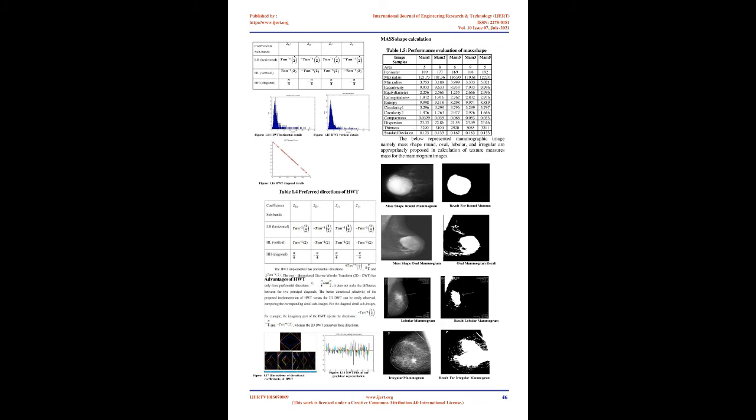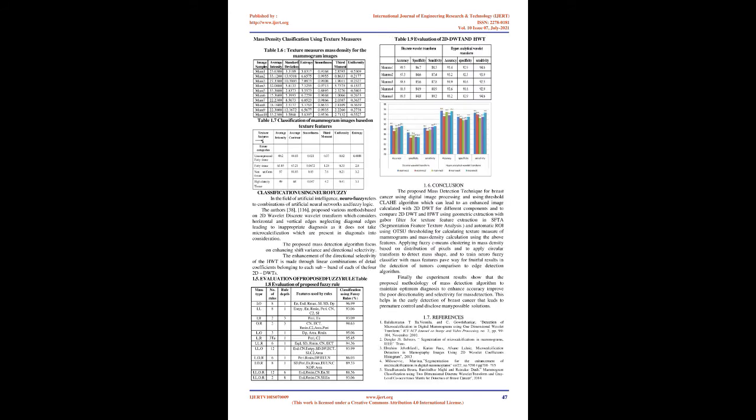The easiest way to get the 2D scale and wavelet function is multiplying two 1D functions. The 2D scale function is achieved by multiplying two scale functions as below. Wavelet functions are accomplished by multiplying two wavelet functions or scale and wavelet functions. The implementation of an analysis filter bank for a single level 2D DWT is shown in the figure. This structure produces three detailed sub-images, LH, HL, HH, corresponding to three different directional orientations, horizontal, vertical, and diagonal, and a lower resolution sub-image LL.